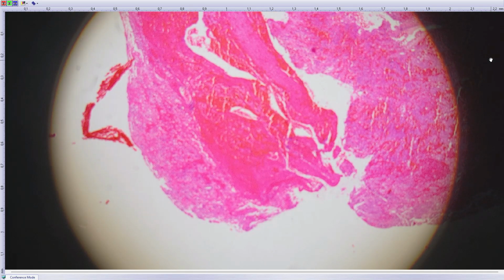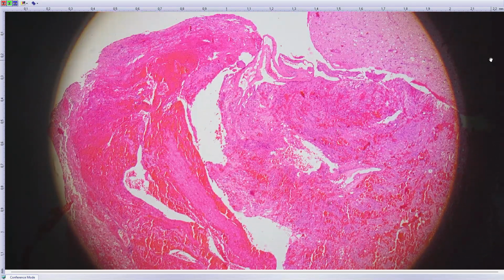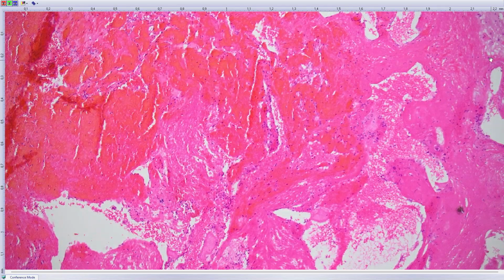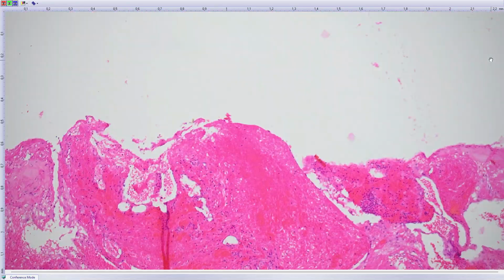This is another brain biopsy from, let's say, a still young adult male, and it's somewhere in the midline structures, a thalamic tumor or near the thalamus, and you can see these hemorrhagic pieces of tissue, so lots of hemorrhage. And there was maybe some necrosis present.